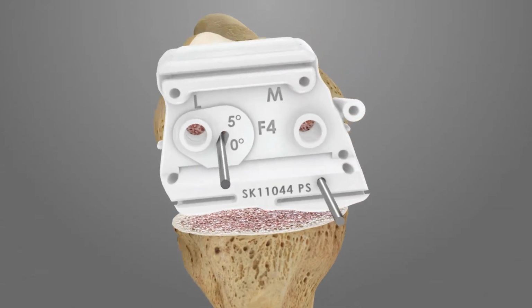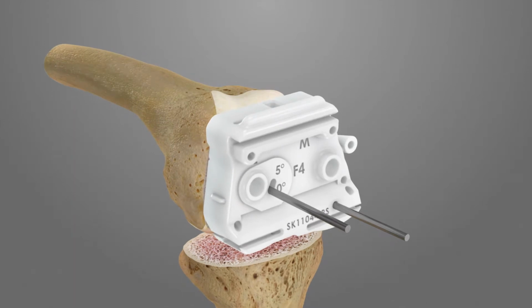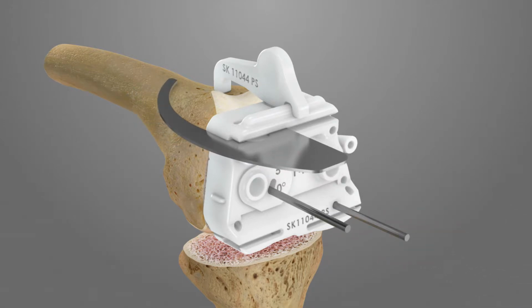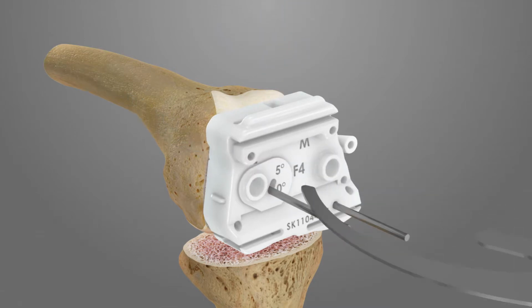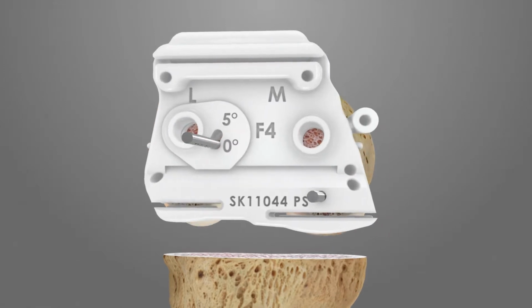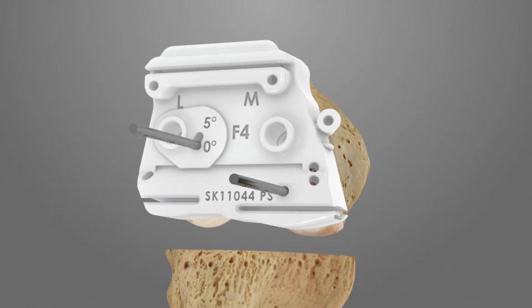the cut surface. The AP iJig stylus F4A can be attached to F4 in order to verify proper placement of the iJig. Use the angel wing to confirm the anterior resection will not notch the femur. Up to 5 degrees of external rotation may be added by rotating F4 around the medial pin. Once proper placement and rotation have been achieved, drill and pin the F4 iJig into place through any of the posterior crosspin holes and insert Steinman pins.